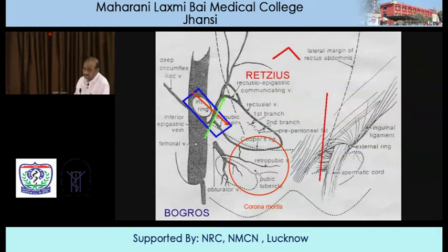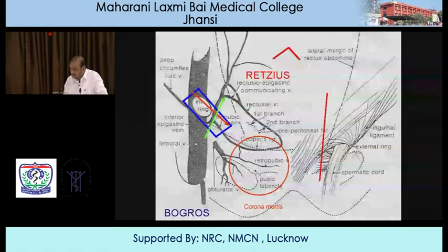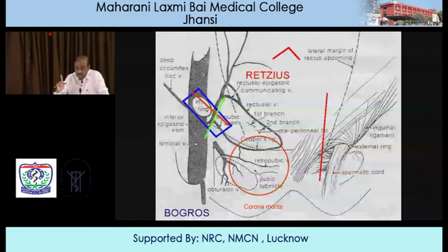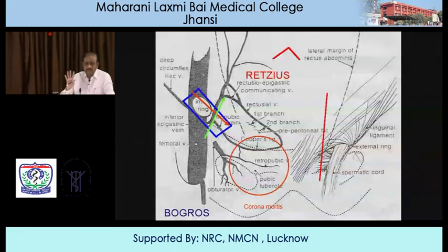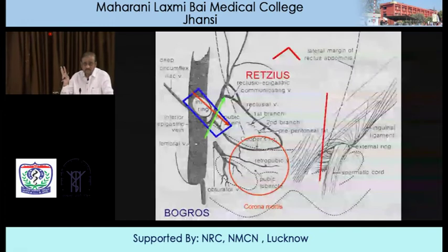Right? So the next time you go in for a laparoscopic approach, always pay attention to this, which is lying just behind the abdominal wall. Again, layer number one and layer number two. So remember, the principle of any kind of laparoscopic repair is always dissect in what? Layer number three. Never between one and two, layer number three. The basic principle of any kind of laparoscopic repair.